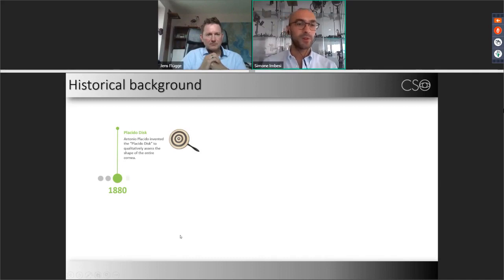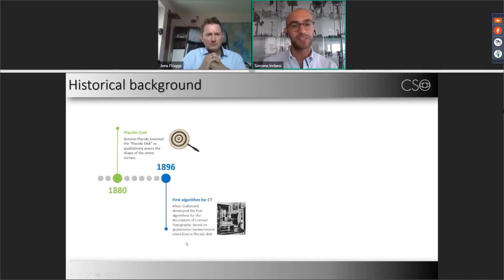Here I reported a brief timeline of the history of the Placido disc from the first development in 1880.